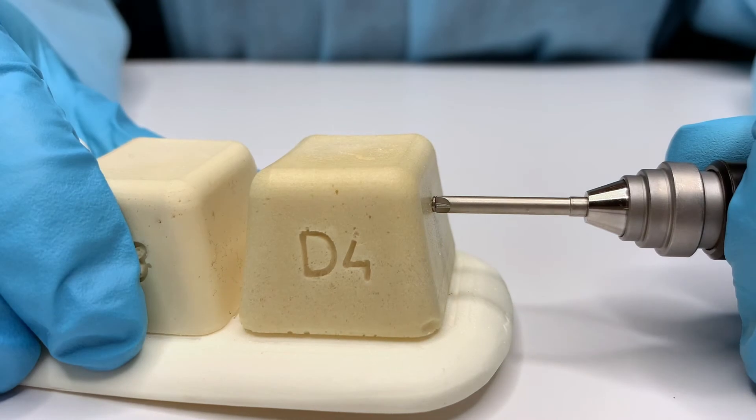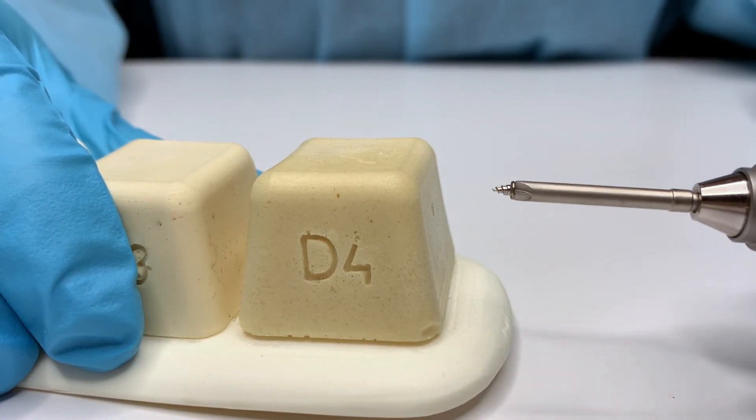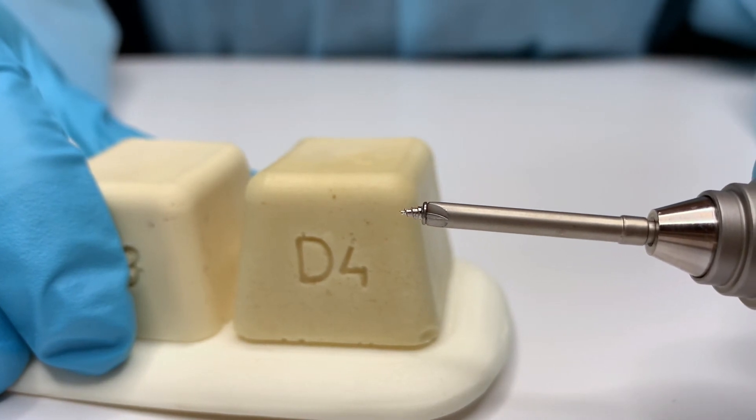If the connection is not properly released and pulled directly out, the screw can be accidentally loosened or removed in sites with soft bone.